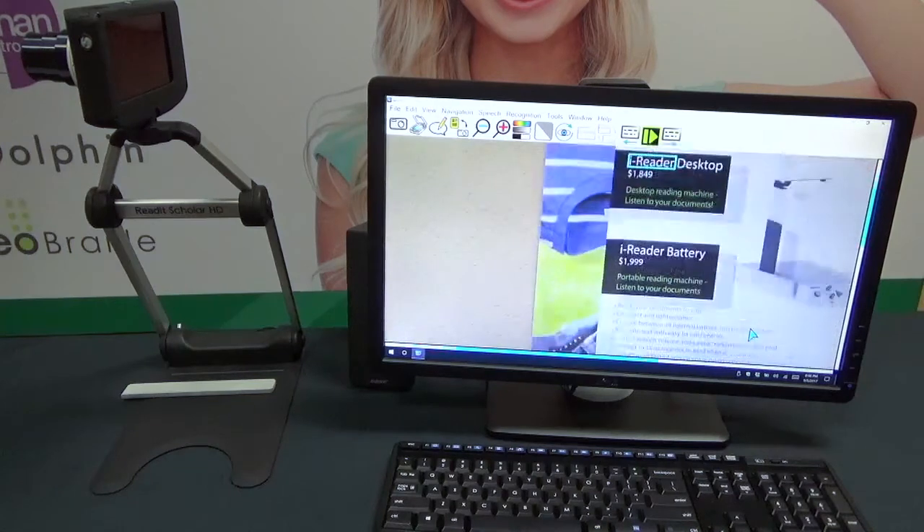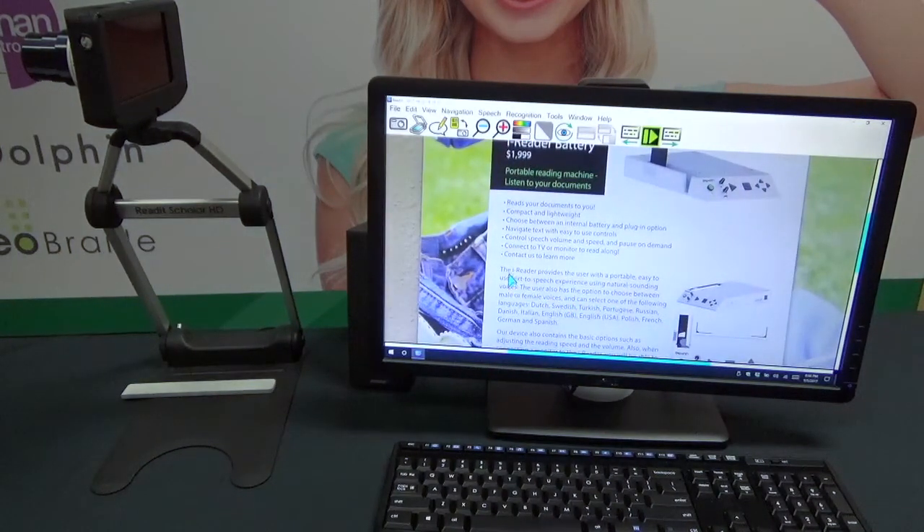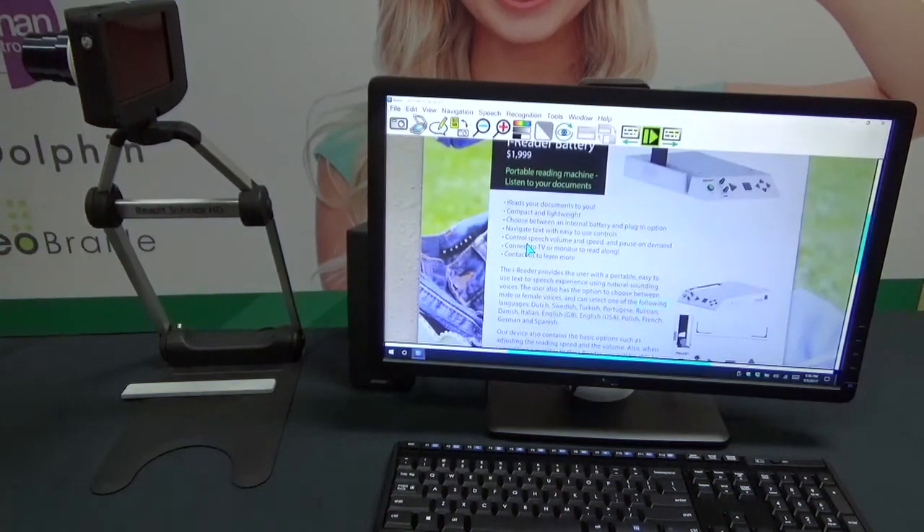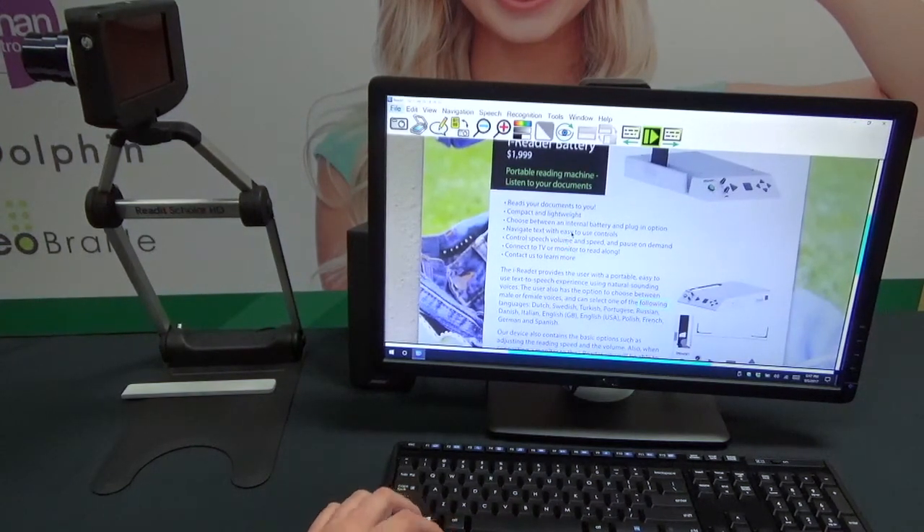I'm clicking here and navigating around my document. I want to start reading right here: 'Our reader provides the user with a portable, easy to use text-to-speech experience using natural sounding voices. The user also has the option to choose between male or female voices.' Just like that — just as easy as it is to scan a document right underneath it, you can also pretty much point and shoot and scan at a distance view. Because of how high-powered the Scholar HD camera is, it has — I believe it's 16 times optical zoom — which is a pretty ridiculous amount of optical zoom where you can get good clarity at a distance. You can actually scan down to about a six-point font very accurately, which is extremely impressive. I've actually scanned a newspaper, which is like eight-point font, all the way across a room, and OCR did a great job.